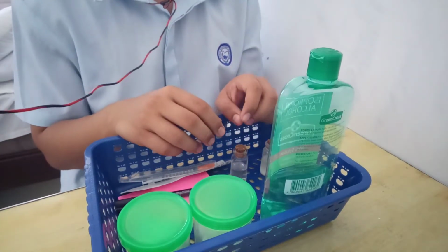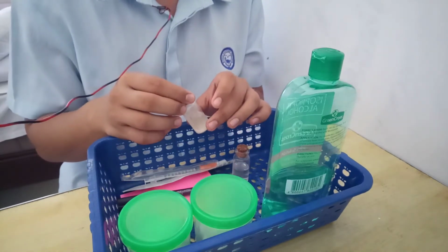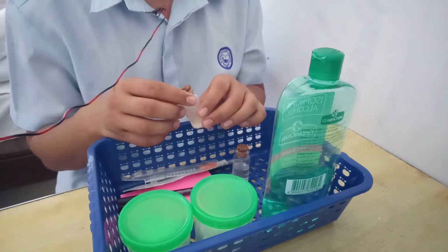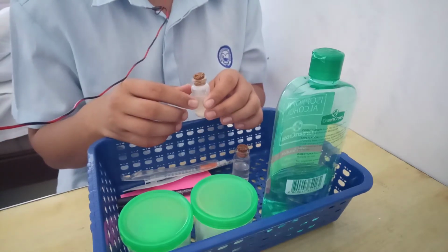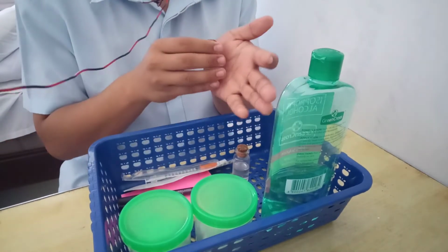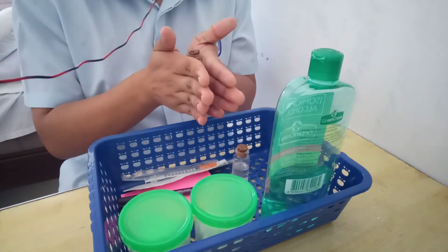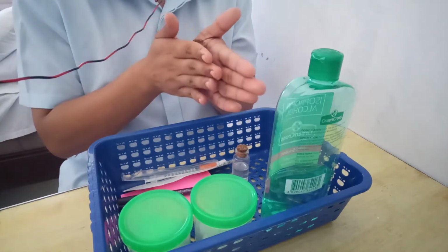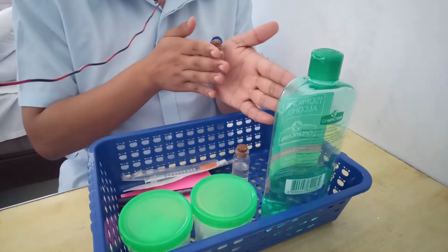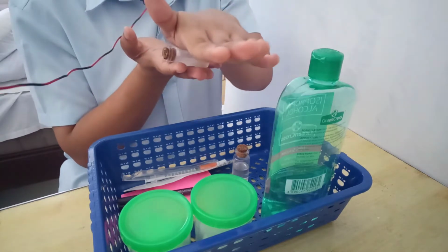Next thing to do is roll the cloudy or the intermediate-acting insulin in between palms for 10 times gently and make sure not shaking it vigorously. We can also do the sideways.